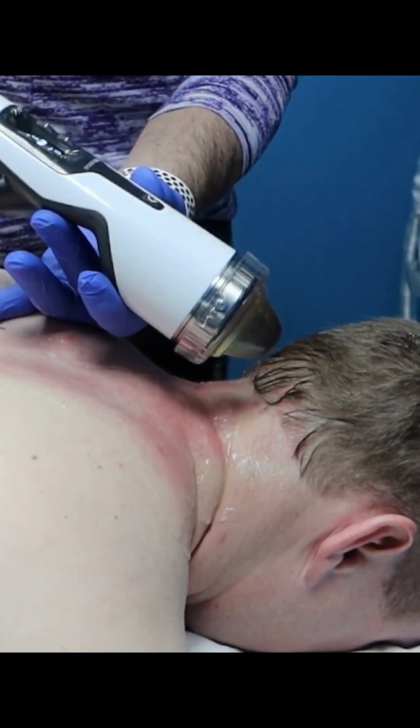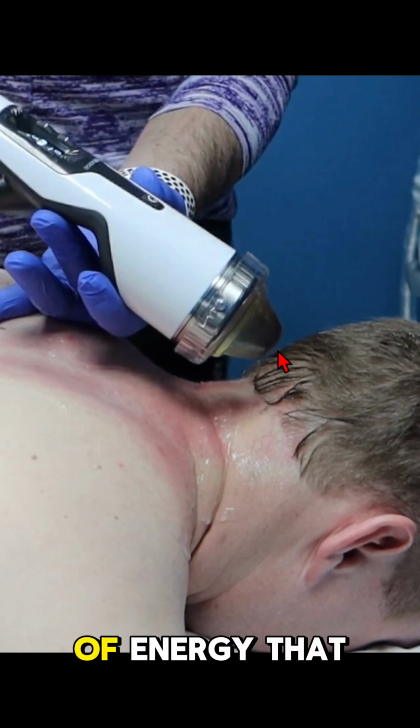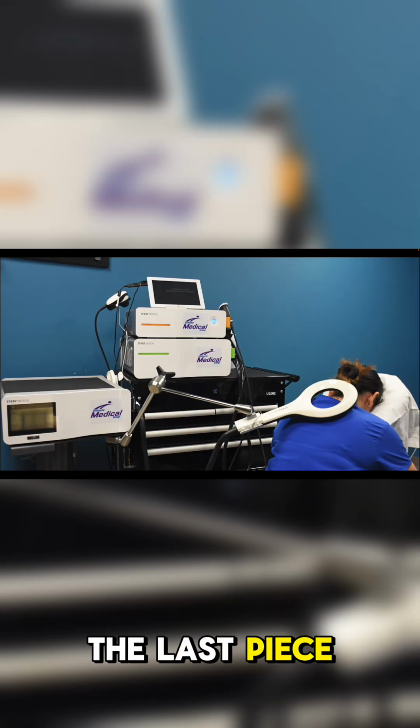And then the second piece of equipment is the focus unit. And this is it just hovering over the neck. And this is me doing a treatment here. But this beam of energy that comes out is a very narrow beam. And so it's a very critical part. The last piece of the puzzle here is the EMTT on the neck area here.